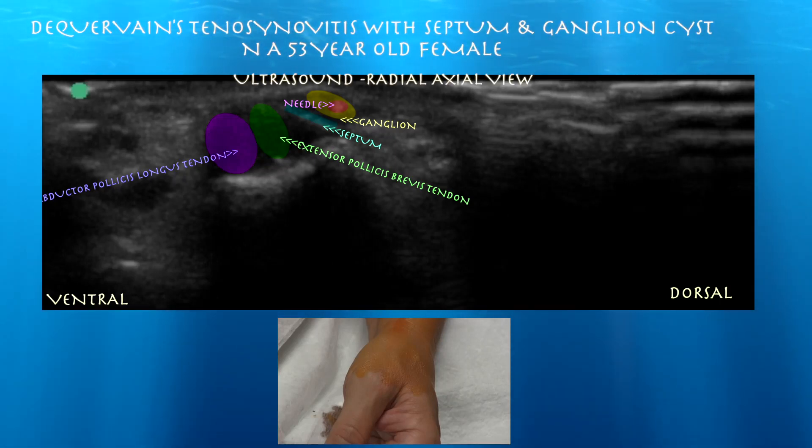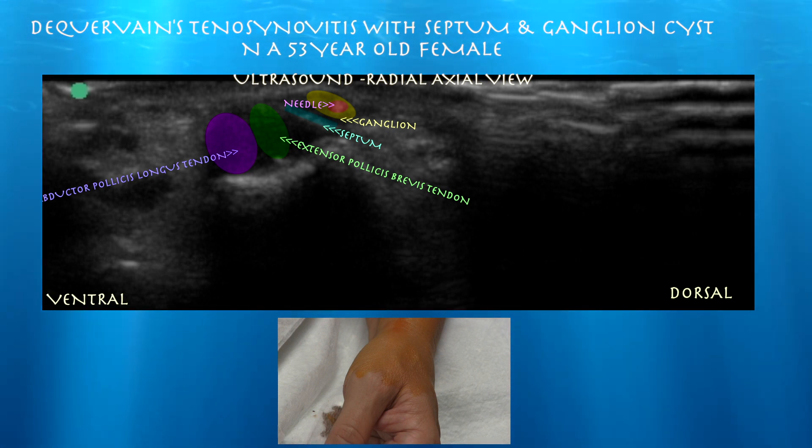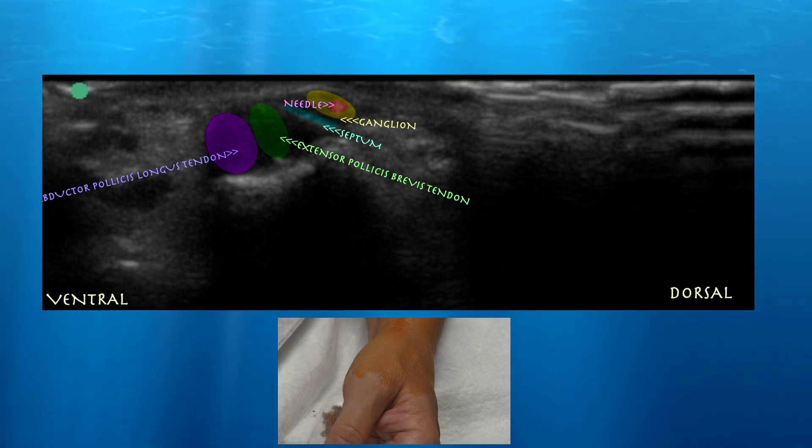53-year-old female presenting with persistent pain in the left wrist. This exam is consistent with de Quervain's tenosynovitis. There may be a little ganglion around the radial styloid process, but it's too small to drain.